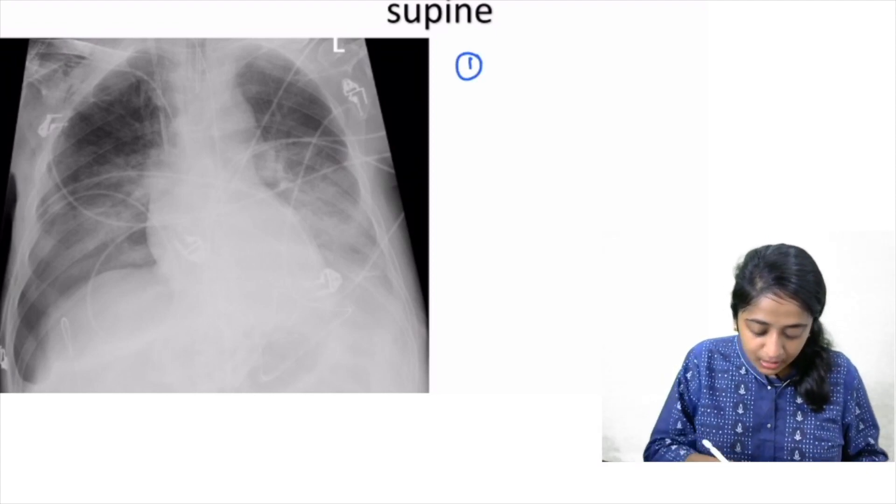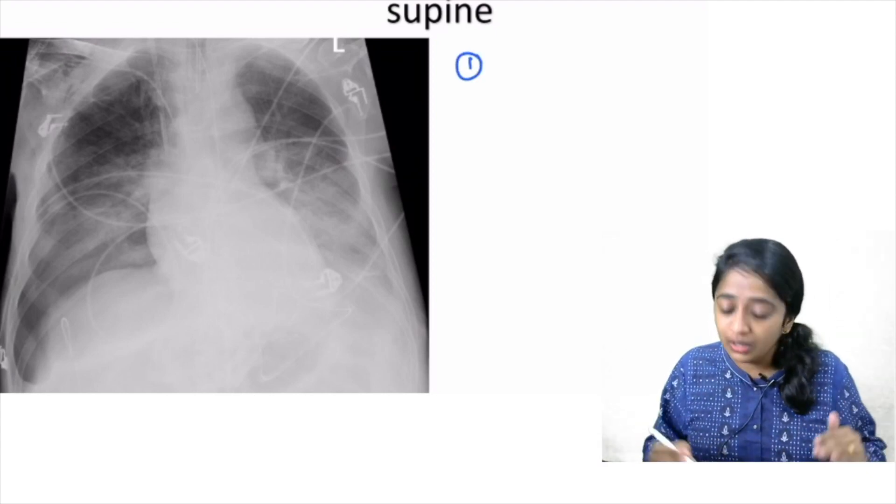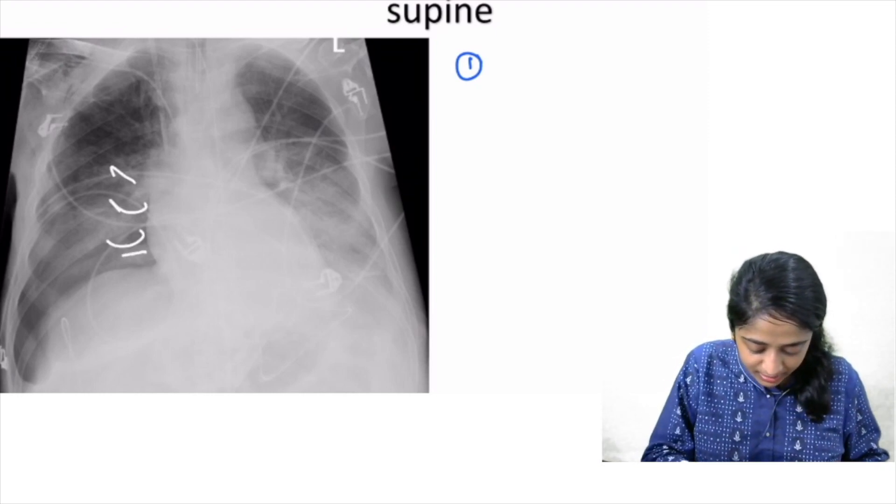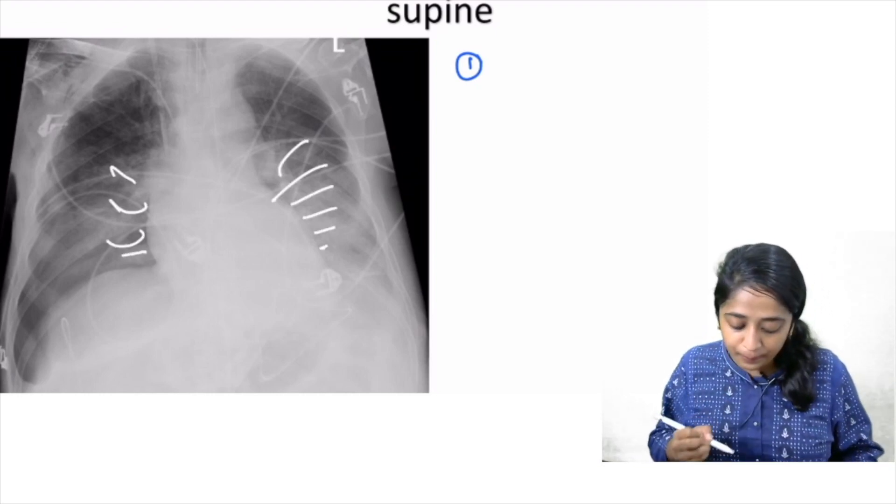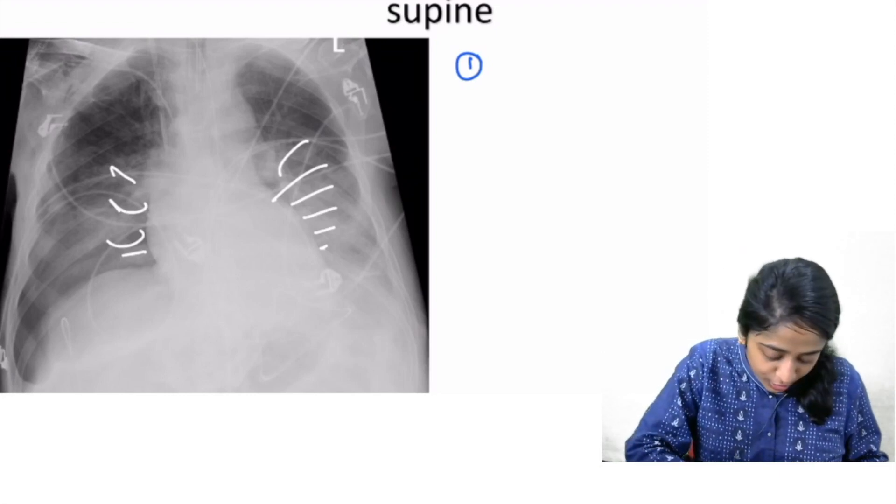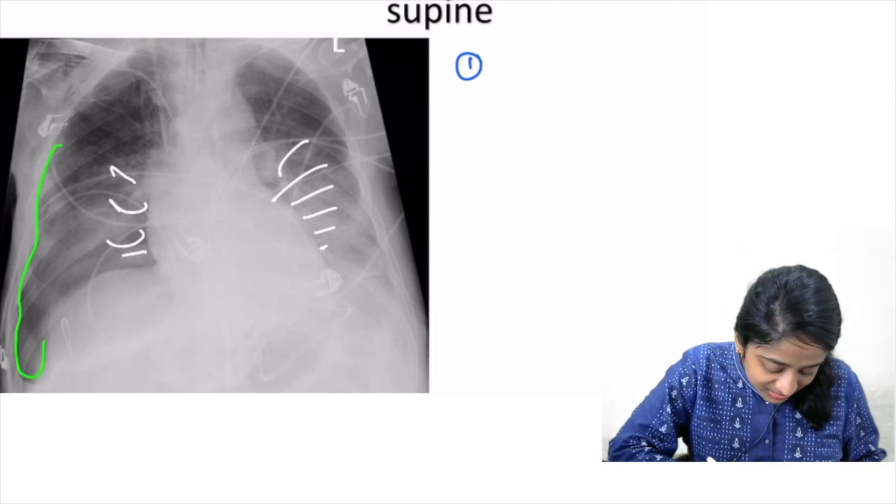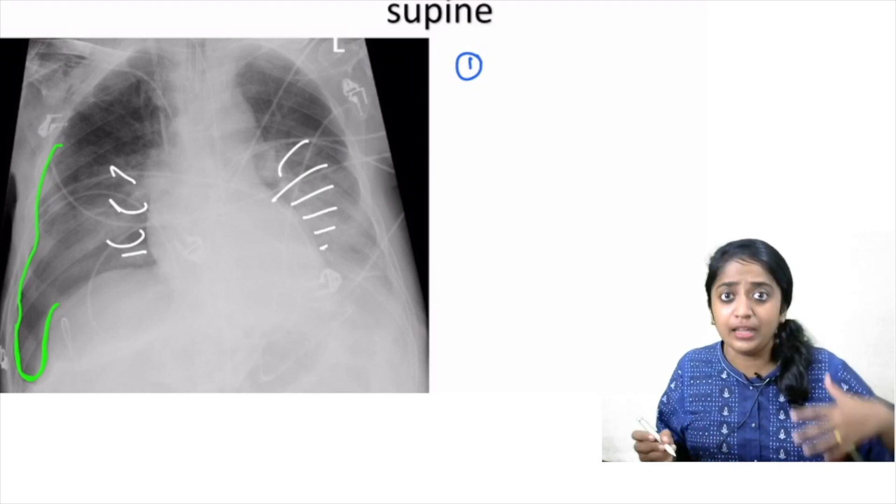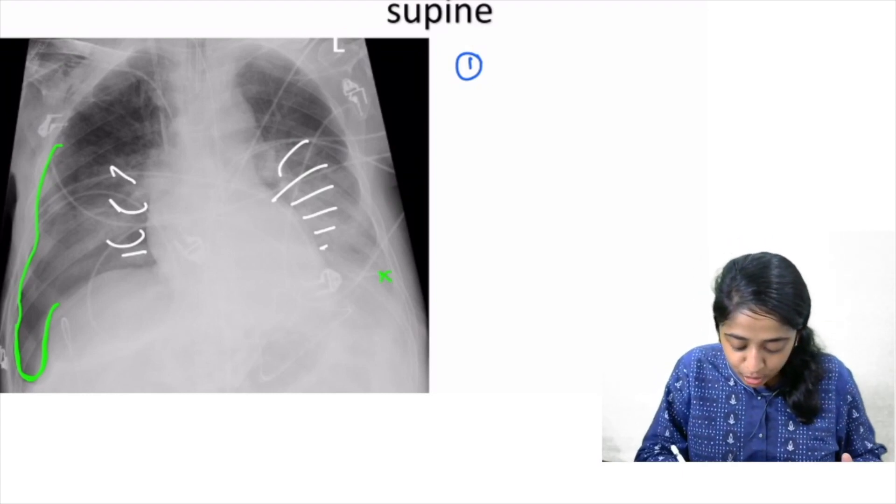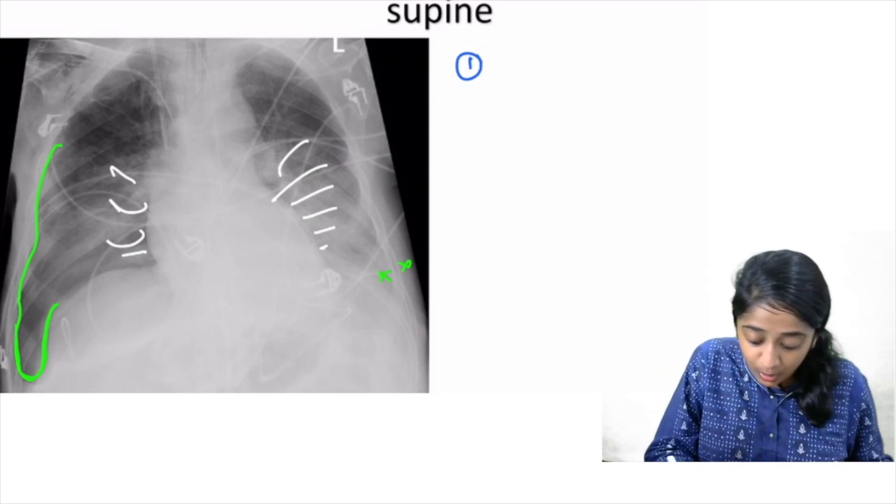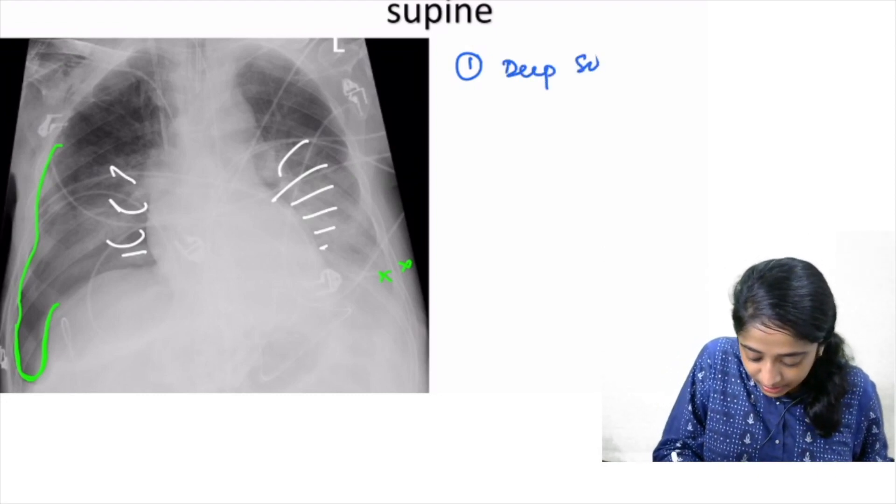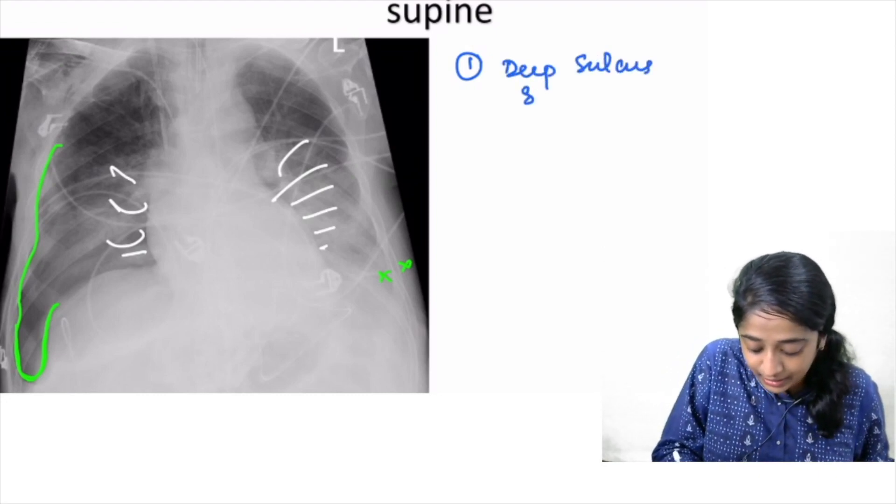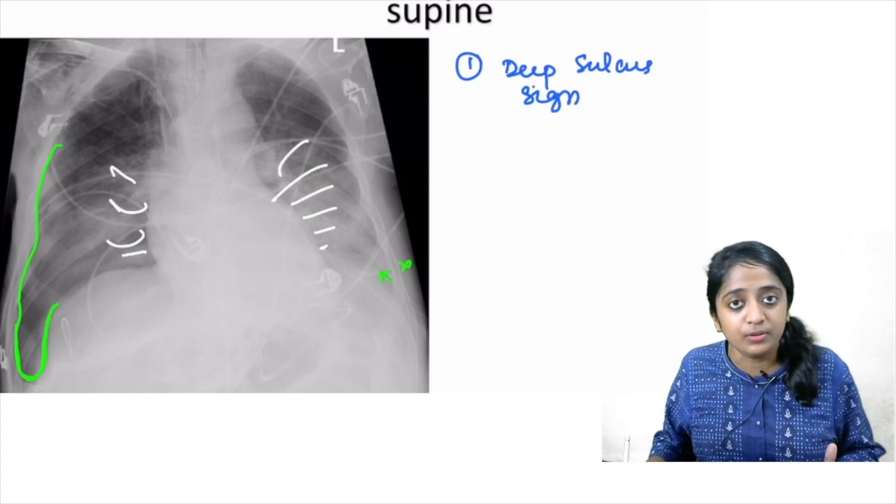Apparently, you can see that both the lung fields, there are perihilar opacities. More importantly, what is the striking feature? You can see that there is a deepening of the right costophrenic angle, which is appearing much more lucent as compared to the contralateral side. This is our deep sulcus sign. So this is the deep sulcus sign that I showed you first in the radiograph.